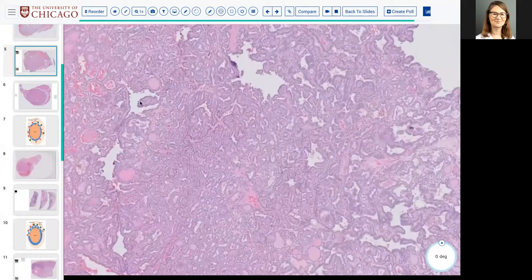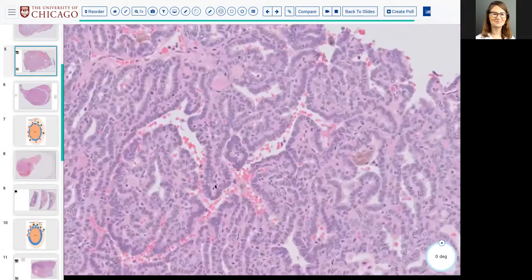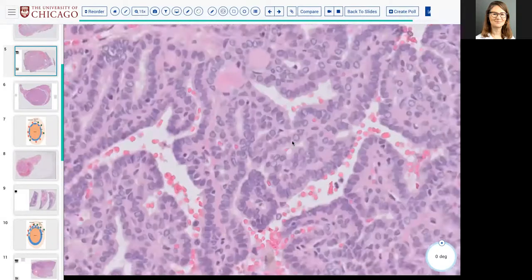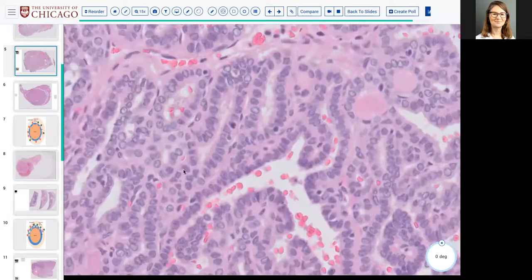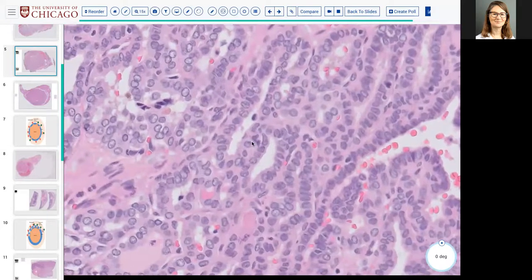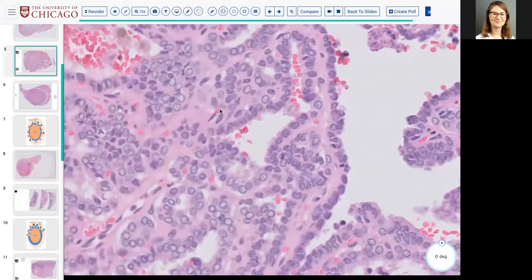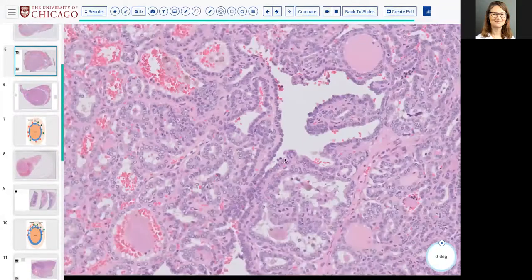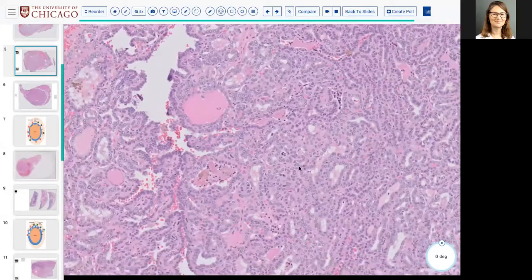Yeah, pooching out. But this pooching out area certainly has papillary architecture and some subtle nuclear features, even if we don't definitely see pseudo-inclusions. One of the criteria for PTC that I also think is important to think about, but is not really mentioned so much, is cytoplasmic characteristics.